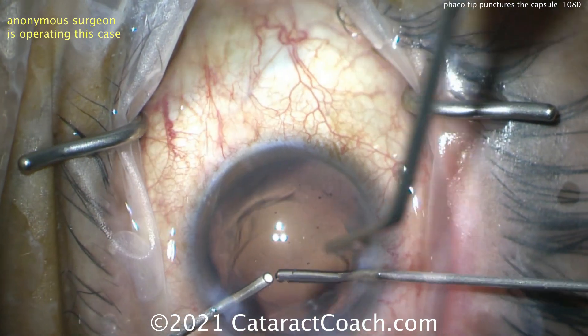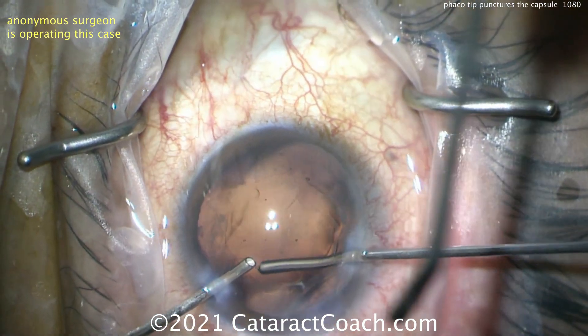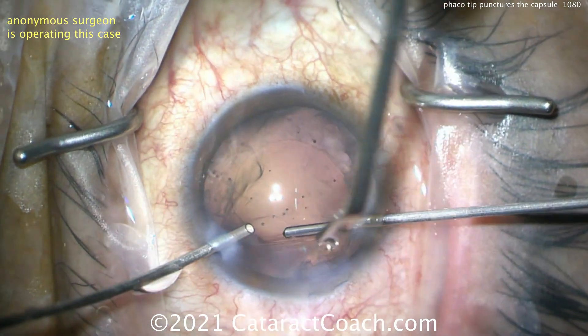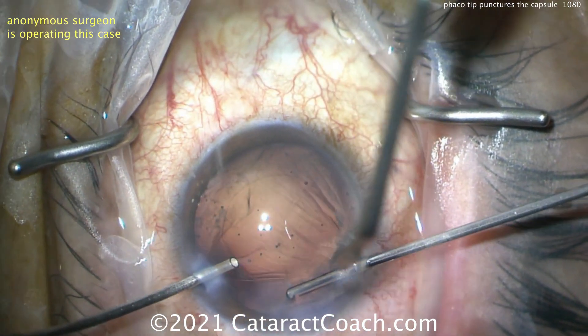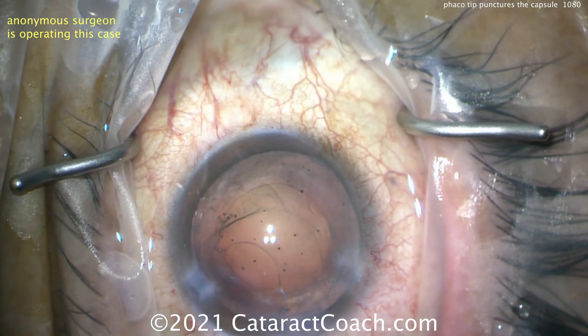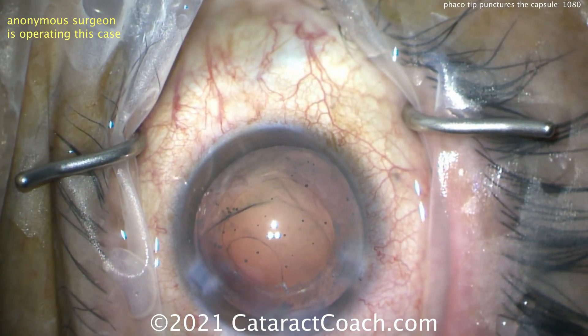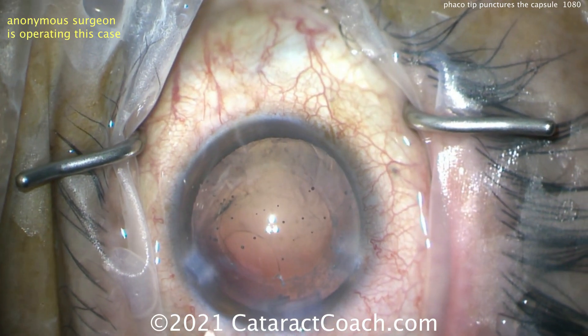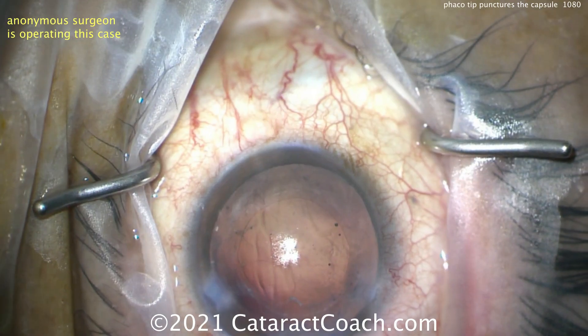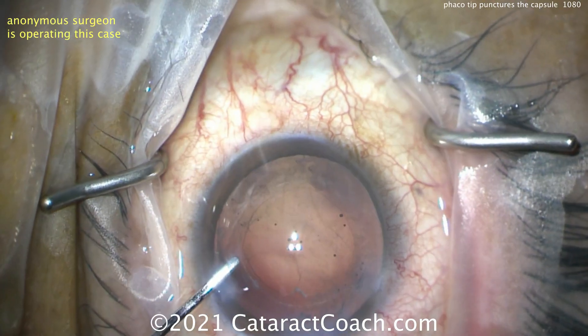Going inside the capsular bag right at that rent — that puncture site — making sure we get all of that prolapsed vitreous out. Luckily it's a small break and doesn't look too bad. Now let's fill the bag with viscoelastic, actually opening up the sulcus — putting a little cohesive viscoelastic under the iris.